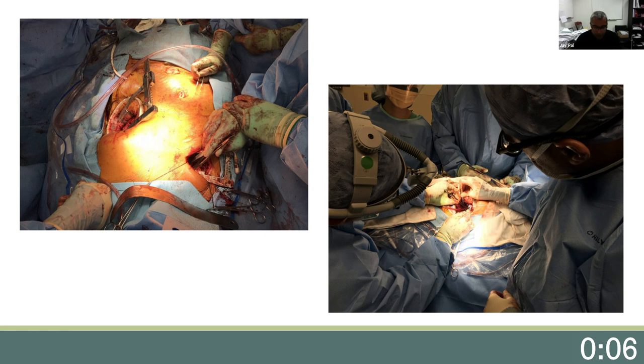Here are two pictures of a bilateral thoracotomy approach for an LVAD implant. You can see from the lower picture that the surgeon with the headlight has an excellent view of the LV apex. In fact, one of the advantages of this approach is that the operating surgeon has a good view of the apex in situ and coaxial to the long axis of the ventricle. This allows for appropriate positioning of the LVAD as well as good visualization of the sewing ring in the event there is bleeding.